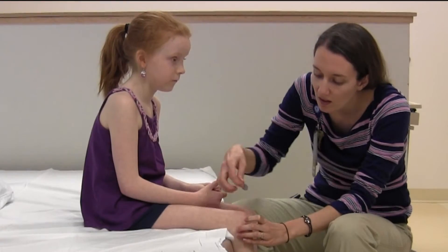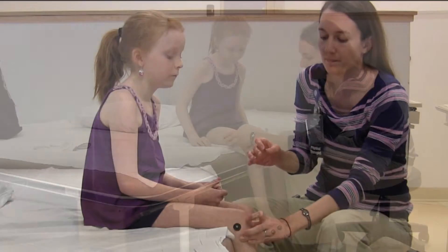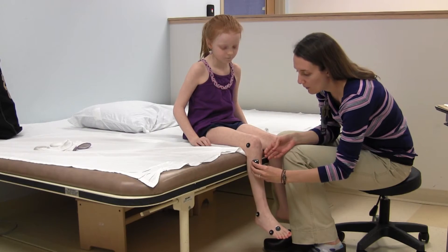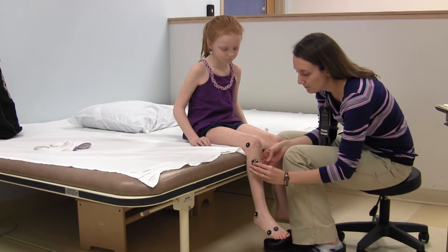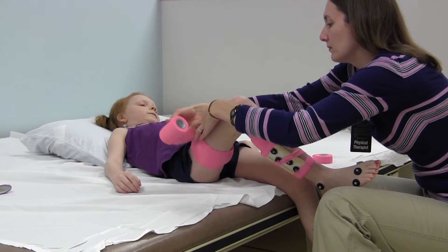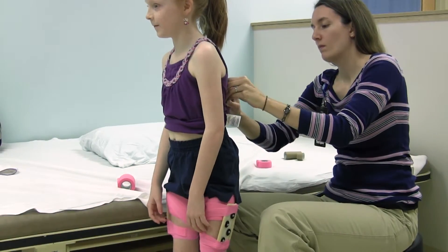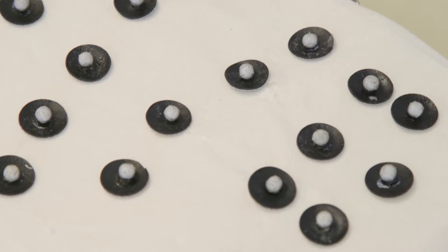Then it is time for the PT and lab assistant to put small black stickers on my feet and legs. They might also put sticker boxes on my legs to watch my muscles work. I will have colored wrap on my legs to hold everything in place when I walk. This will not hurt me. They will need to roll up my shorts and pin them in place so the stickers don't get covered up.